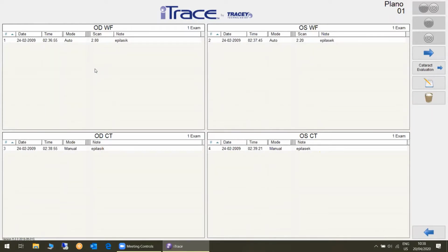Those people for laser vision correction, they are young and their eyes are a little bit too long or too short or a little bit skew. And they want to get rid of their glasses. I want to use aberrometry for understanding people who don't see very well, and I use ray tracing technologies.